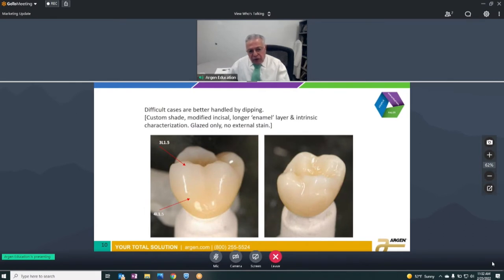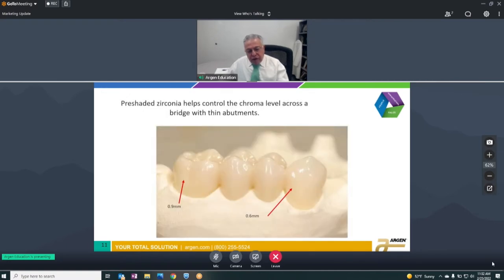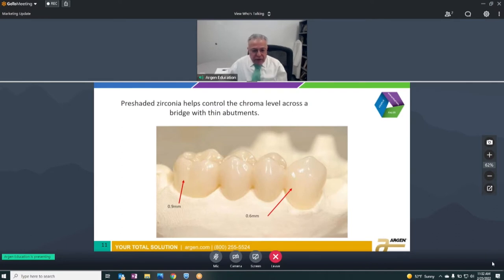Some difficult cases still require dipping — for instance, when the doctor wanted two different shades on the same crown. Pre-shaded was a godsend when it first came out. Here we have two pontics and two abutments with a very thin abutment on the right, and you still get the same shade. With coloring liquids we had a problem with pontics absorbing too much and becoming dark.